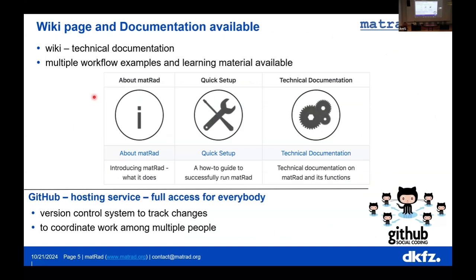You also have a lot of documentation. So if you really want to go into research or do something more with it, I have to say it's the problem of any research software. We are always behind on documentation. We are happy if we can implement something new and exciting for the people, and then we forget to document it nicely, or the documentation is from 3 years ago. But you find some explanations about how the data looks and so on. And of course, you can always write any problems or questions that you have on GitHub, and we try to answer them as soon as possible.